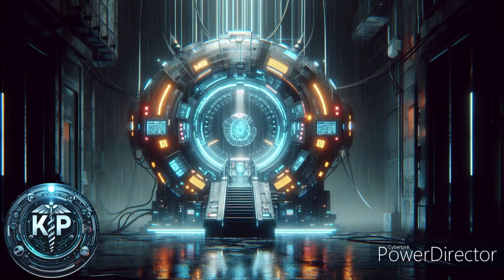Control room. This is where the MRI technologist operates the scanner. It is usually shielded with RF shielding and has a window that allows the technologist to see the patient during the scan. Quench pipe. In the event of a quench, a rapid loss of superconductivity, this pipe safely vents the helium gas used for cooling the magnet outside the building.